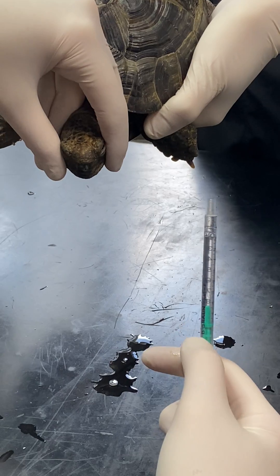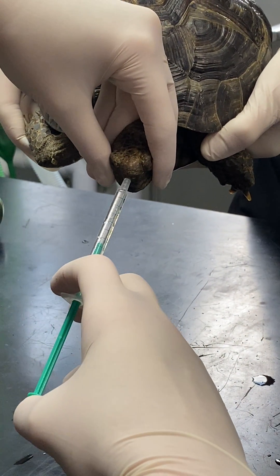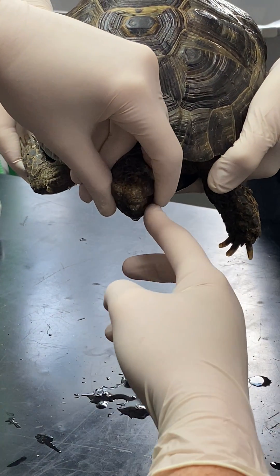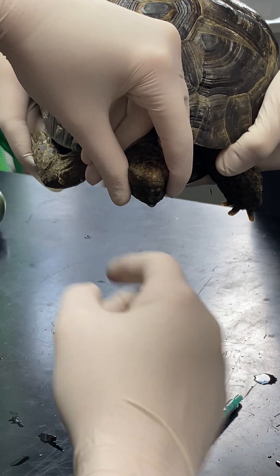I've got the pre-drawn up antiseptic solution here and I just place my syringe over one of her nostrils with her head facing down, and we literally just flush it straight up there. It comes out of the nose and out of the mouth, and you can see it's clearing out some of that discharge as well.